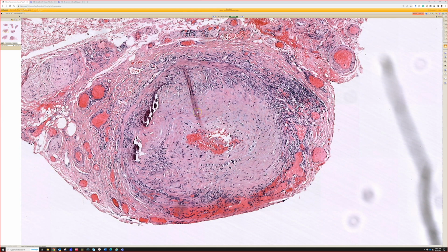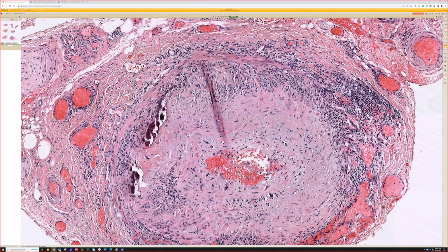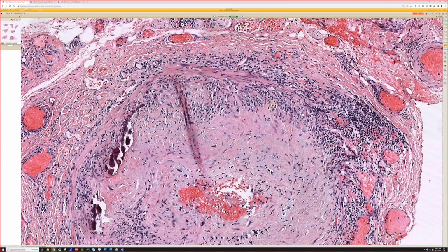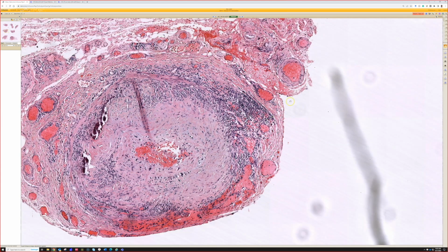And as we all know, high-dose corticosteroids are powerful drugs that can do great things, but also come with a lot of side effects that can be quite serious sometimes. So that's the significance. But if you have any doubt, find your local friendly ophthalmic pathologist, and they often have a lot of experience in dealing with these. But this one is a really florid example.